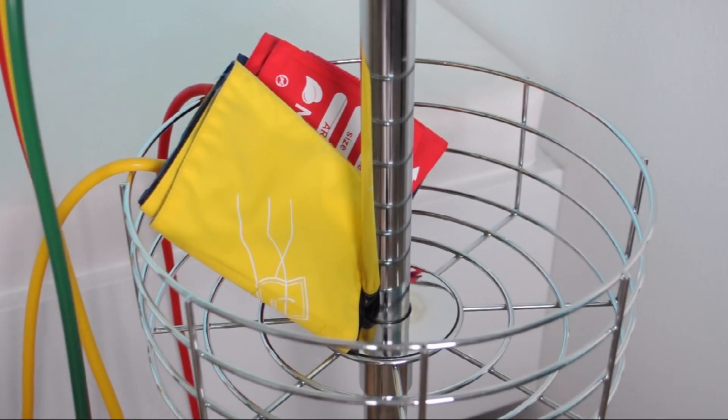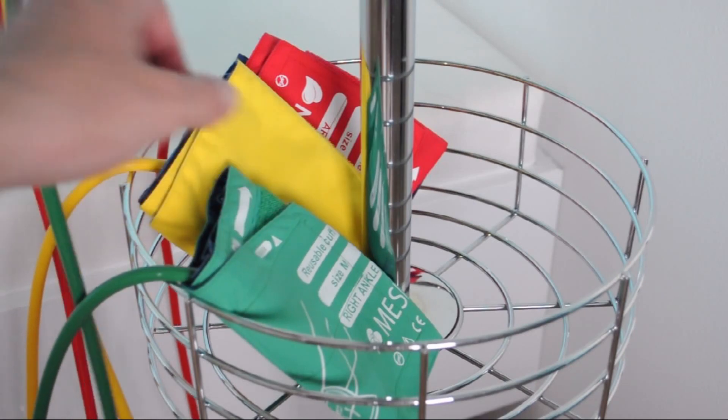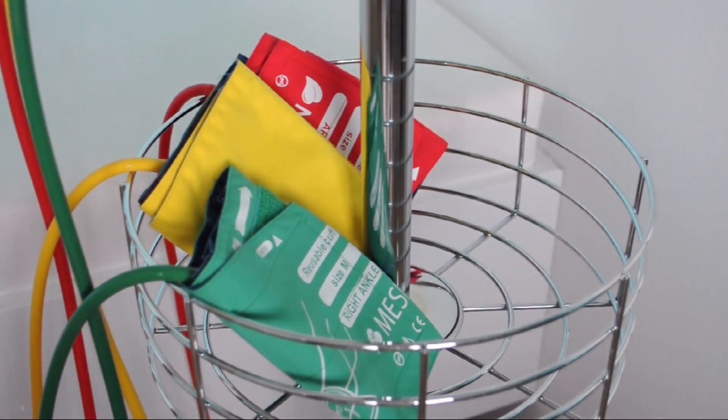The ABP IMD stand provides safe and easy storage for the cuffs, preventing the cuffs' tubes from tangling and damage.